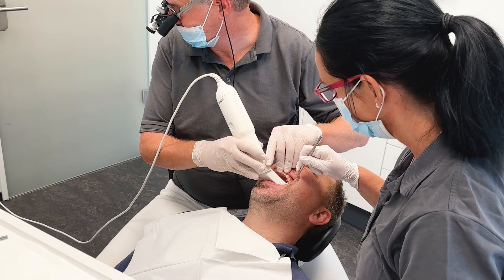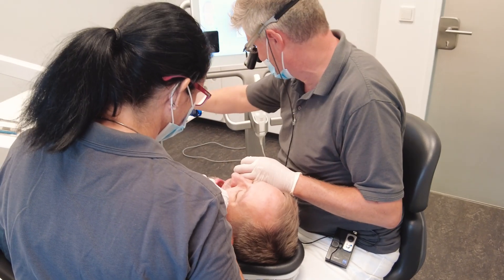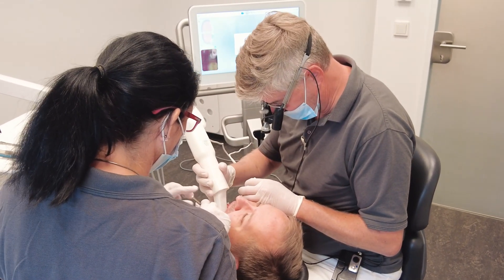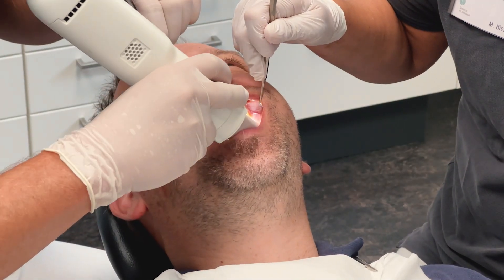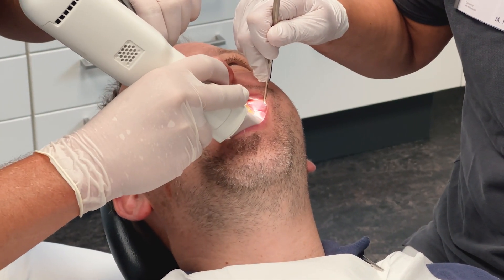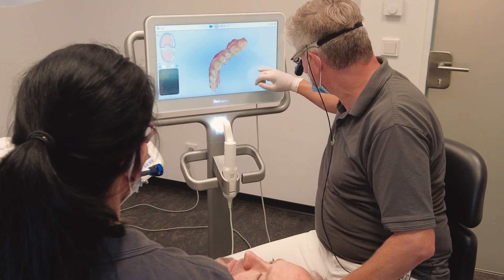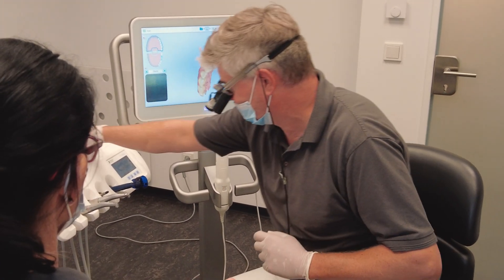Dr. Herzberg takes the digital impression with an intraoral scanner. He scans the patient's dentition, including the preparation and the implant. This takes about two to three minutes. In real time, we can see which areas have already been scanned on display.